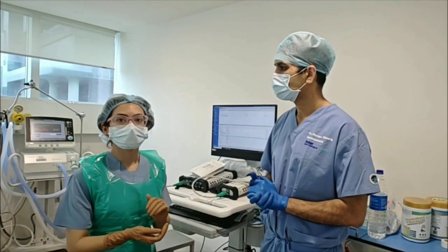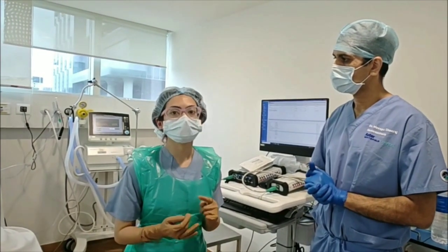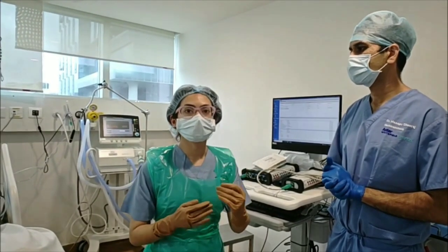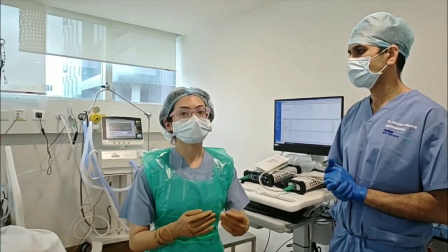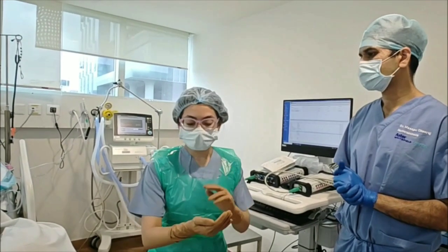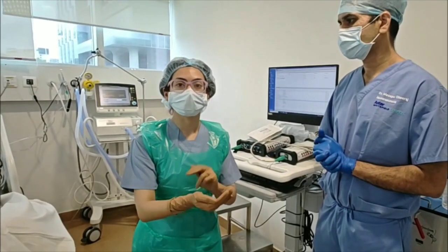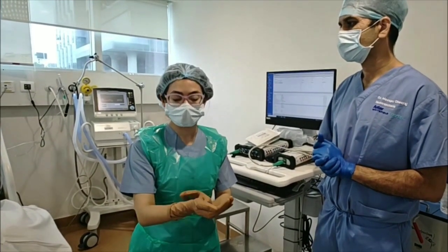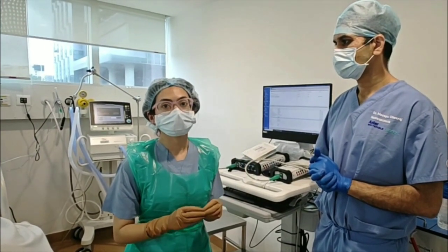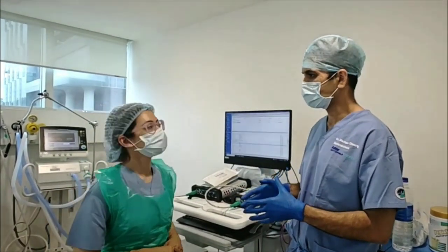For connecting SSEP, I will be using stimulating electrodes. You can use two types: needle electrodes or patch electrodes. I'm going to use patch electrodes here, though the only problem with patch electrodes is slightly higher impedance. The stimulating patch electrode will be connected between the tendon of palmaris longus and flexor carpi radialis. For the recording electrode, we'll be connecting on the primary sensory cortex, area 3-1-2.